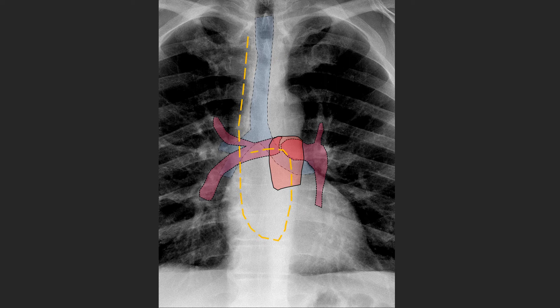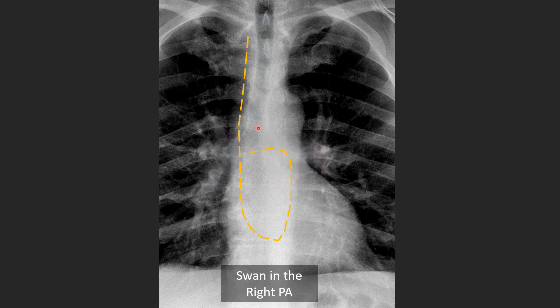Here's a catheter within the right pulmonary artery. We can see it entering the main pulmonary artery and then having this horizontal course. We can see that it terminates below the right main stem airway, which is in here.